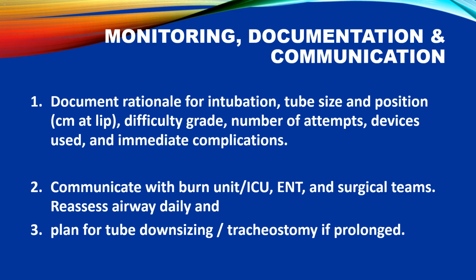Monitoring, documentation and communication. 1. Documentation. Rationale for intubation. Document the rationale for intubation. Tube size and position. Record tube size and position, cm at lip. Difficulty grade. Document the difficulty of intubation. Number of attempts. Record the number of attempts made. Devices used. Document the devices used during intubation. Immediate complications. Note any immediate complications.